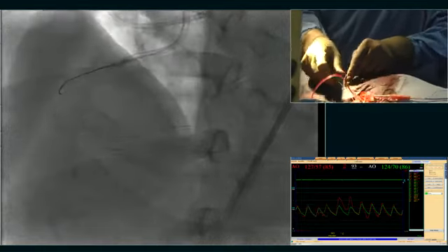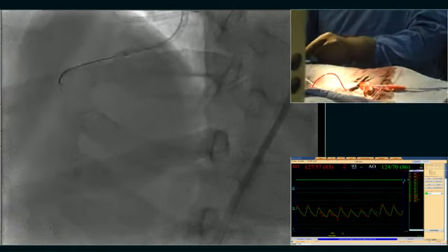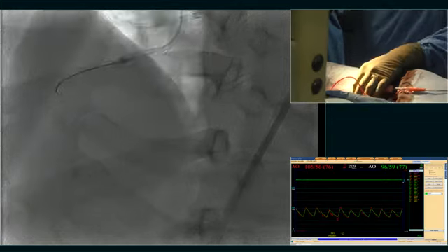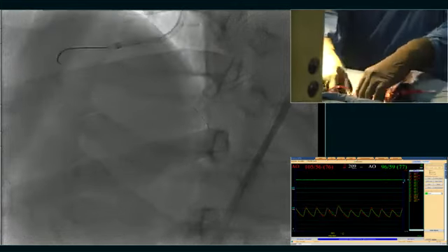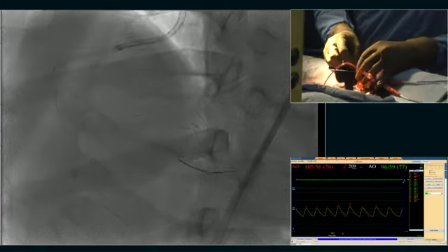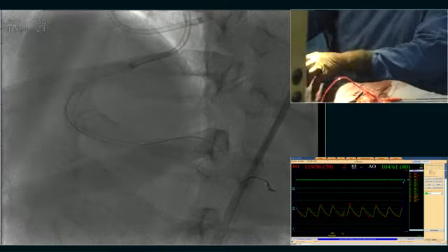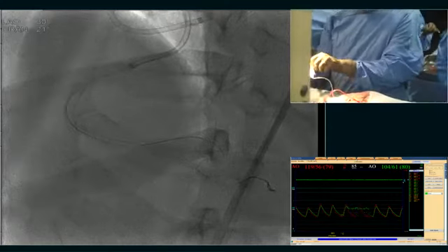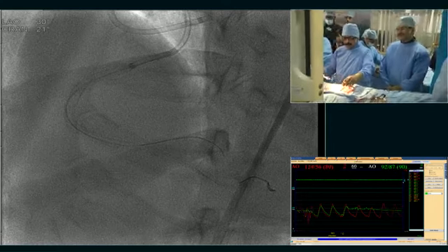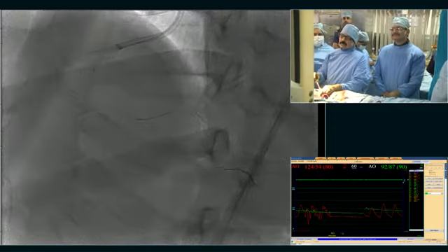So do you have another solution? Going back to PDA and post dilate with a larger balloon. We have done it already. Now I'll give a final antegrade injection here. You can dilate it with a 3.5 so that it will open. But Sapphire 1.0 is a good one.